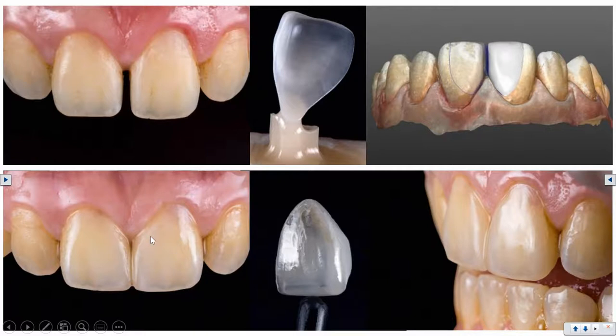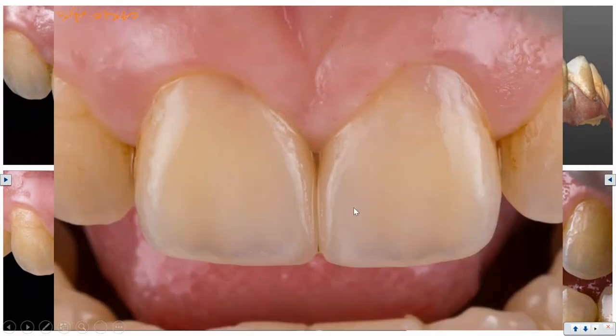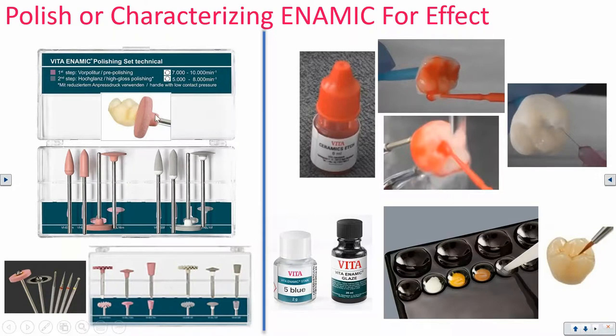Using a neutral adhesive bonding cement allows the characterization staining to influence the final appearance without blocking light. With these thin veneers, the bonding cement can show through, so you need preps that are close in color to the desired result to use a transparent bonding cement. The end result looks natural — light remission, reflection, and refraction through the prep — replacing enamel and making a truly aesthetic case.